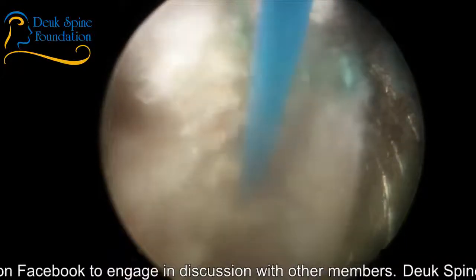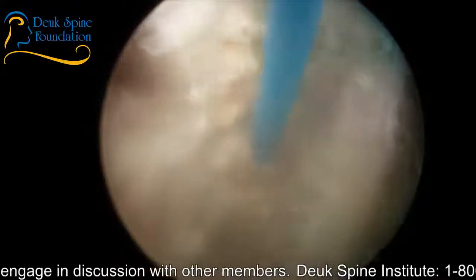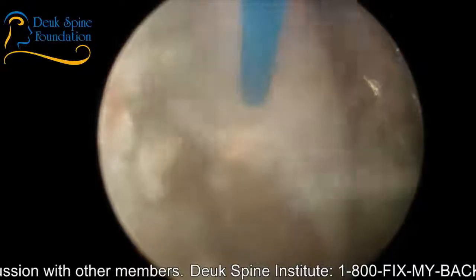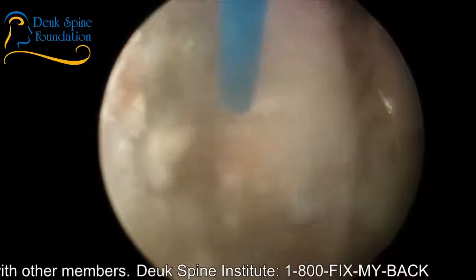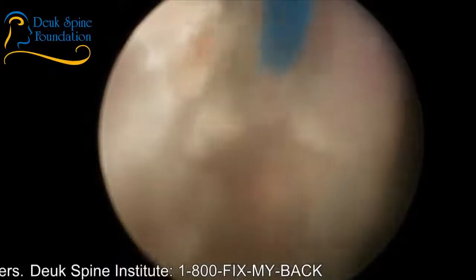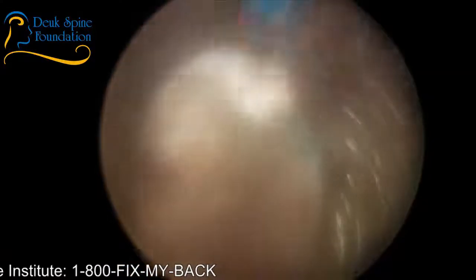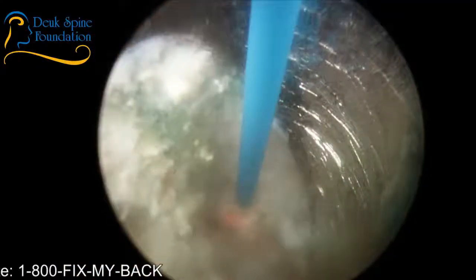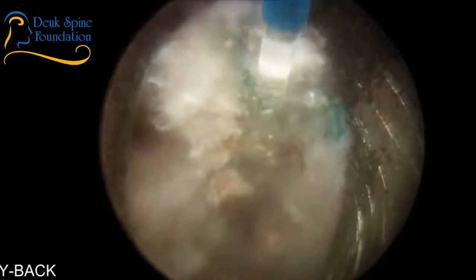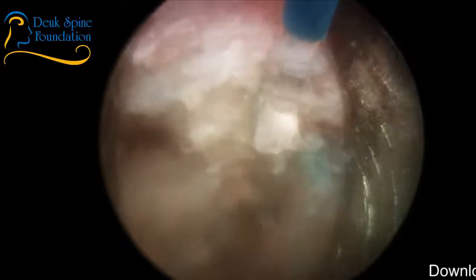For those of you who don't know, the blue line that you're seeing at 12 o'clock is the laser fiber. It brings the laser energy from a machine which is about the size of a washing machine. It's at the foot of the patient's bed, and that machine is plugged into the wall. I think it's on a 220 circuit, right? It's on a 220 circuit. Everything else is 110, but that machine is 220. It's a very powerful machine.